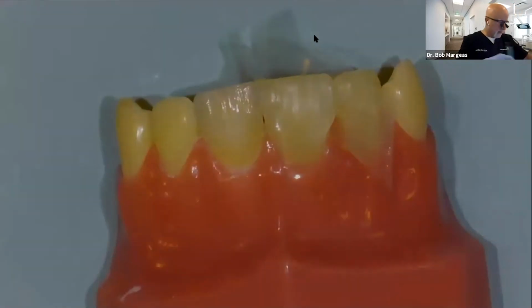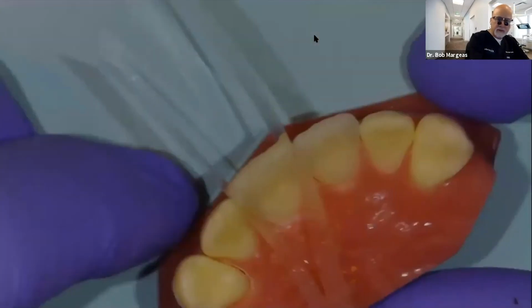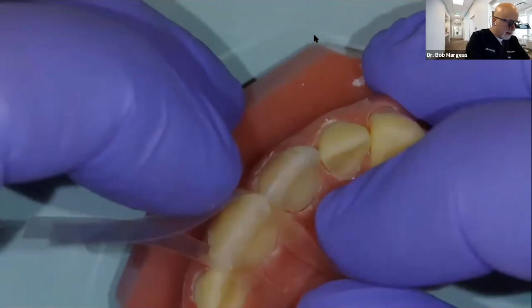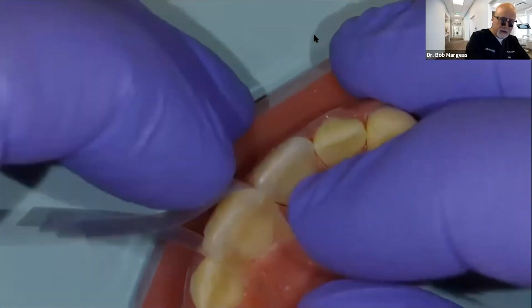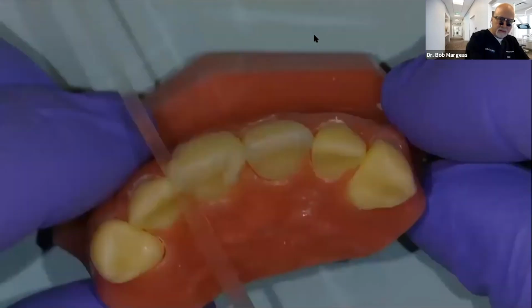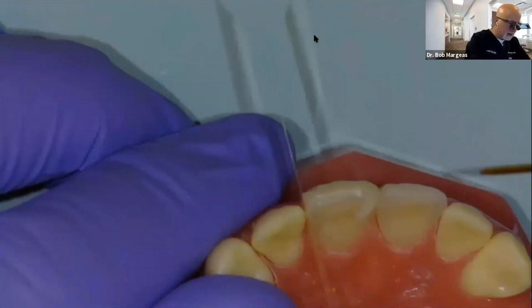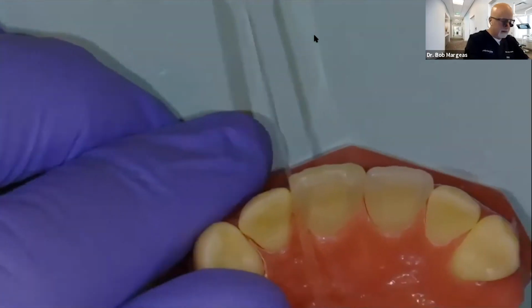And now I want to show you my first pull through technique, right? So now you see the material here, it's against that strip. What I do is here, I take my finger, I push, and then I lightly just pull this through. I want to drag the material here because I'm not using a wedge. And you notice how that just comes through on that interproximal. And then I'm going to take my instrument and I'll clean this off.